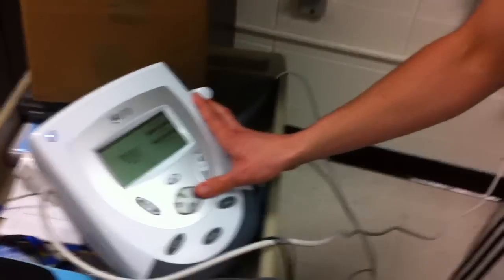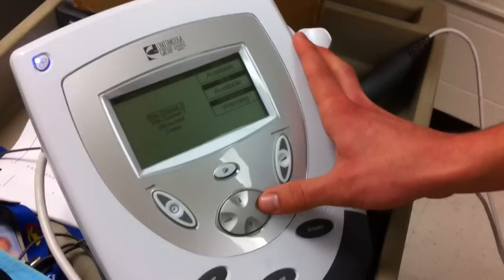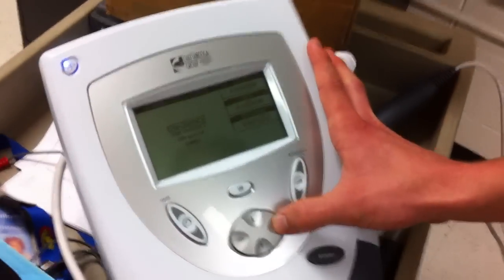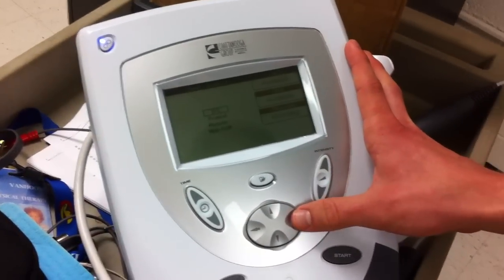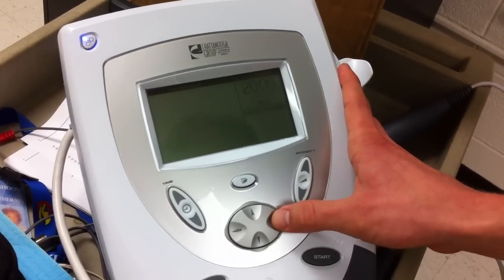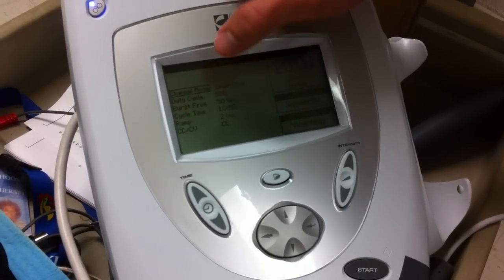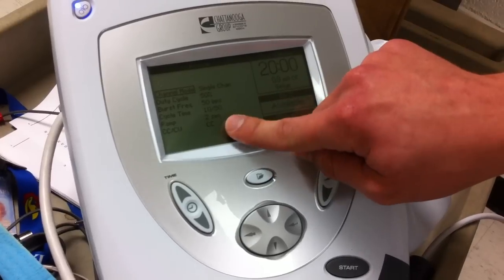The parameters for my Russian E-STEM: we're on STEM channel one, select Russian, and we're going to have a duty cycle of 50% with a two second ramp time.